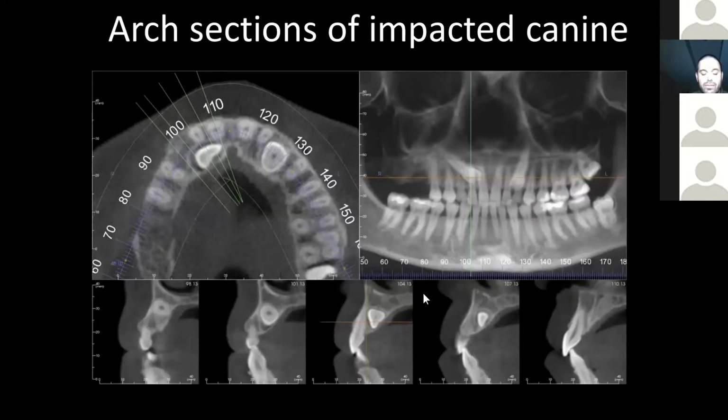But what I get from it is another axial view here. This is just like the axial view in our MPR view we just covered. Turns out that that axial cut is right from along this orange line here, exactly. You can see we've got a couple impacted canines, and I'm seeing them right here and here. So again, this exact line tells me exactly where this slice is coming from. But on top of that, you'll notice I've got 5 green lines right here.